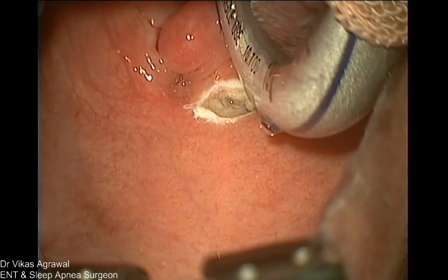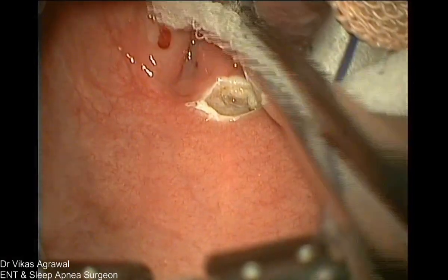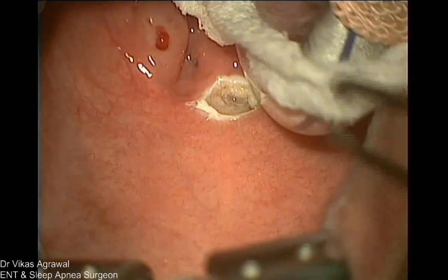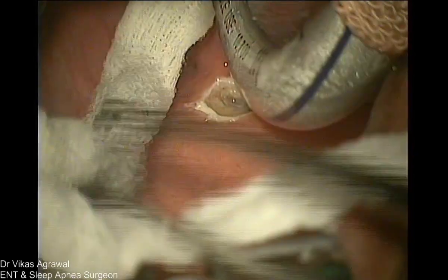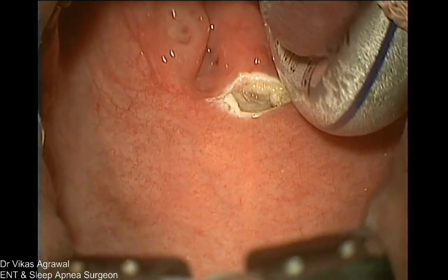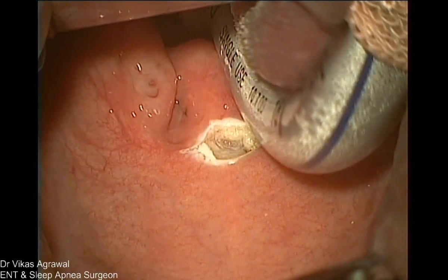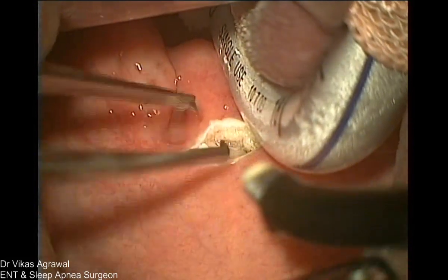Give me a bigger throat pack. I am pushing a throat pack on the lateral side of this tube so that the tube remains out of my view. We want to keep the tube out of the way. We could have done nasal intubation, but we have to do the nose surgery, therefore we cannot do a nasal intubation.